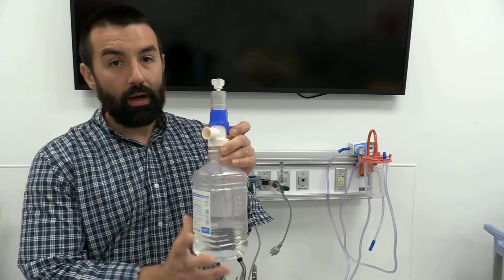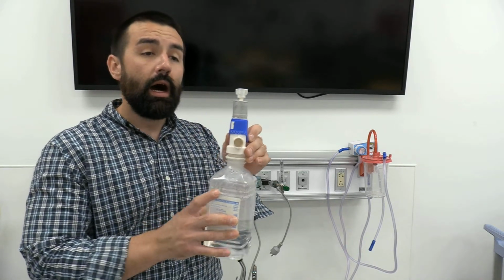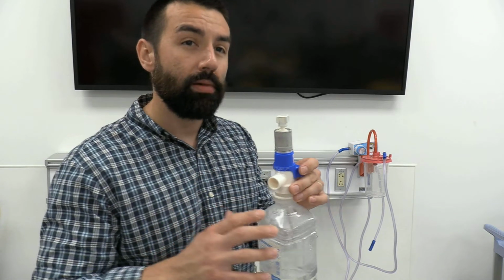And once again, we'll talk about a way to navigate through this, although rather rare. Okay, we'll talk about a tandem and a bleed in, but we'll also talk more about some of these servo-controlled heated wire circuit high flow devices that are a much better option for your patient when you have the ability to do so. They're a little bit more complex though.